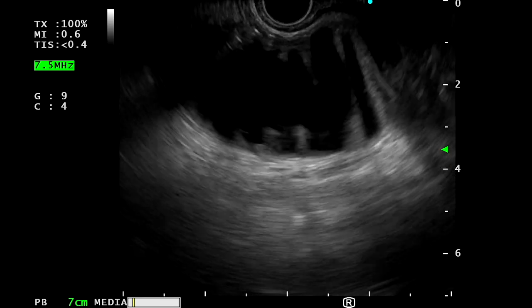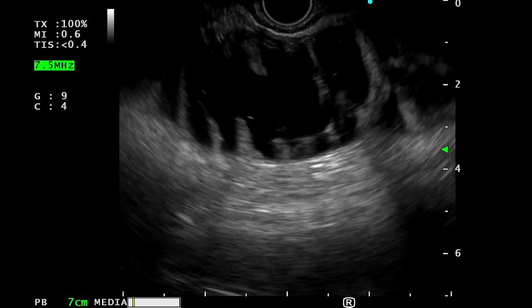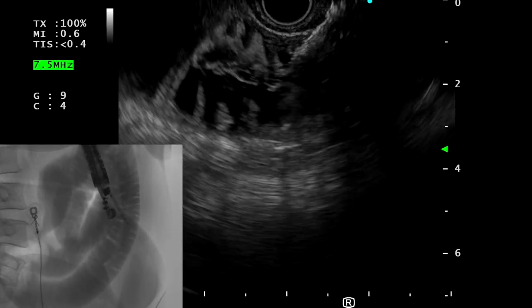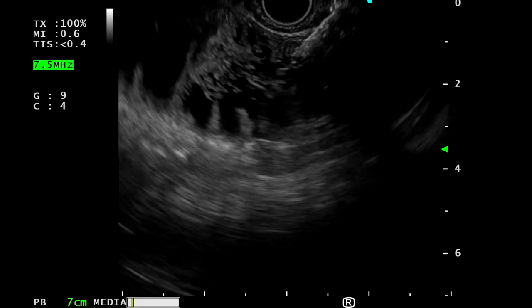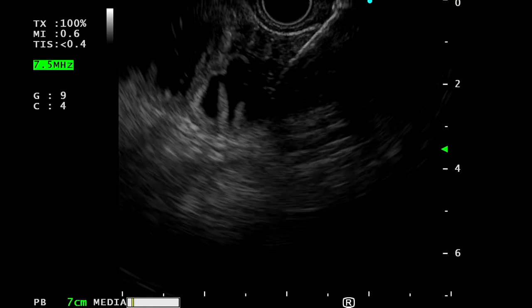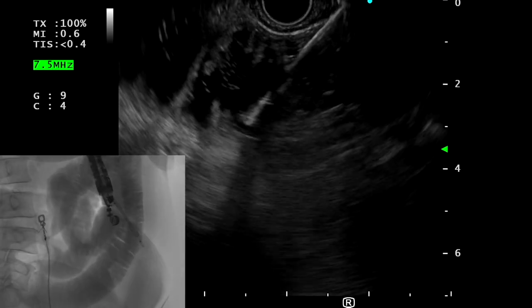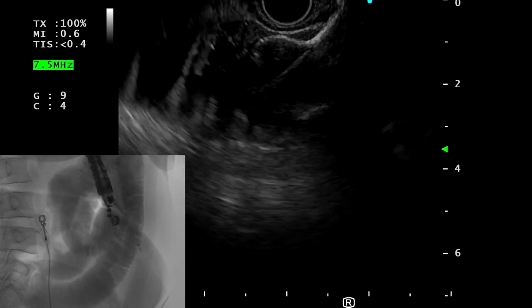Once the optimal loop of jejunum is identified, the cautery-enhanced delivery catheter of the AXIOS lumen-opposing metal stent is inserted directly through the gastric wall and into the small bowel lumen. The most important factor in this step is to start applying cautery a second or two prior to pushing the delivery catheter through the gastric wall, and to apply rapid and firm pressure to ensure passage of the catheter tip through both the gastric and jejunum walls.